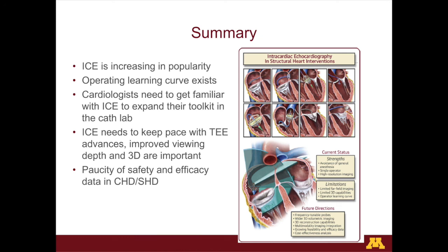ICE has to keep pace with TEE advances. Improving its viewing depth and 3D are extremely important so that it can compete with TEE. Although there is a paucity of safety and efficacy data in congenital heart disease, I believe there is more data coming, and ICE is definitely as safe as TEE and has a lot of advantages.